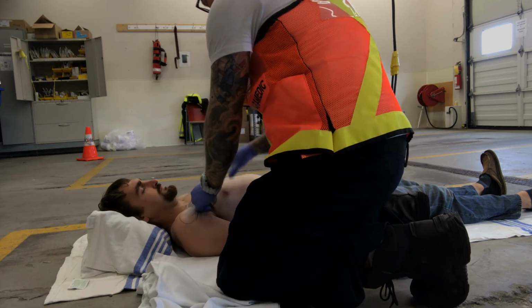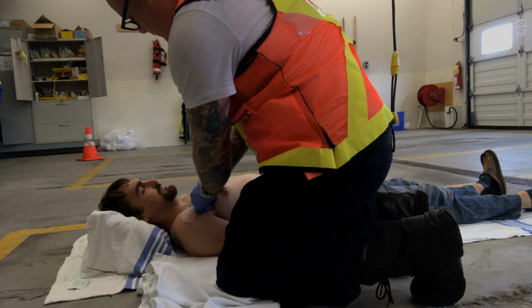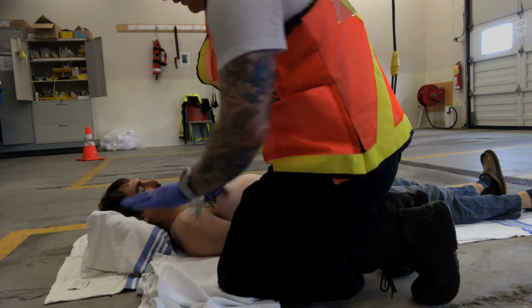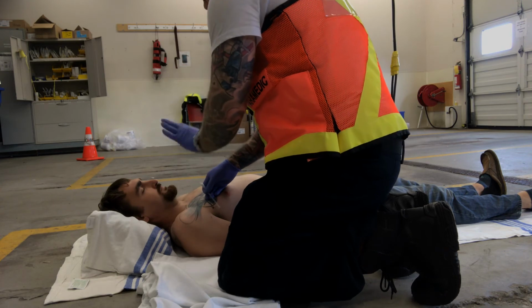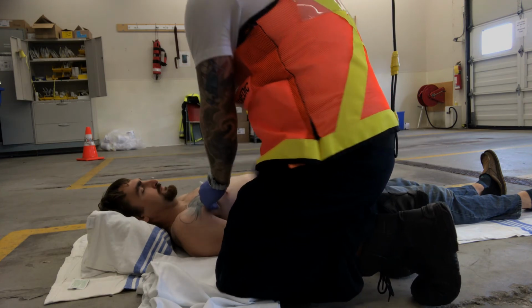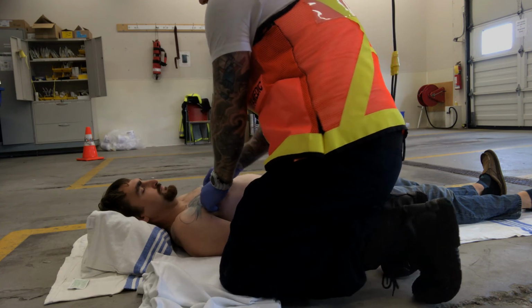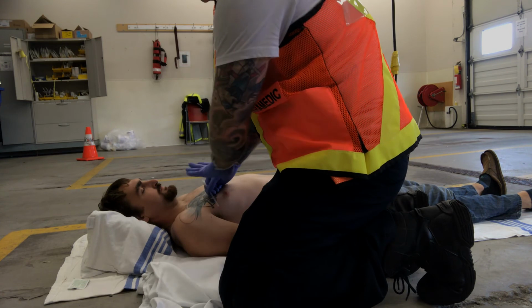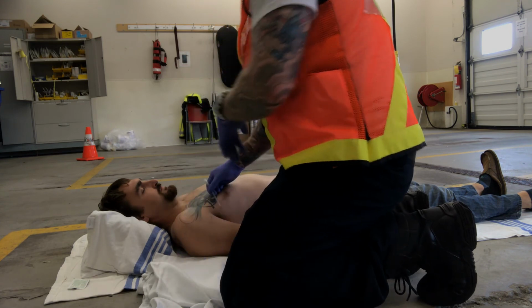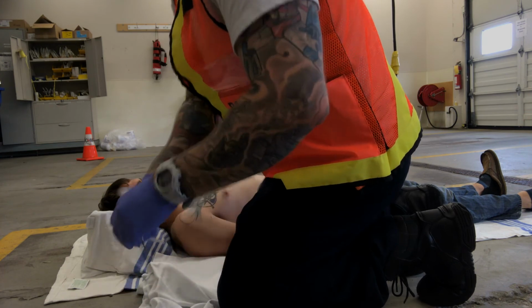I'm going to look for any changes in chest rise, and I'm not going to apply anything on top of this. I'm going to leave it in place and maybe tape it down just to know where it is. Leave it exposed at all times. Reassess the patient.